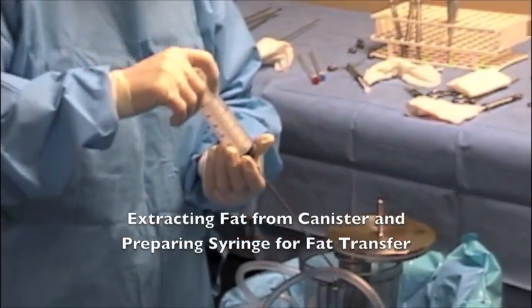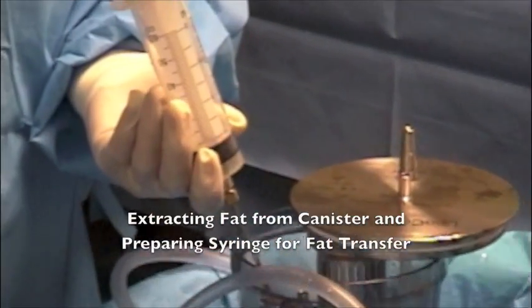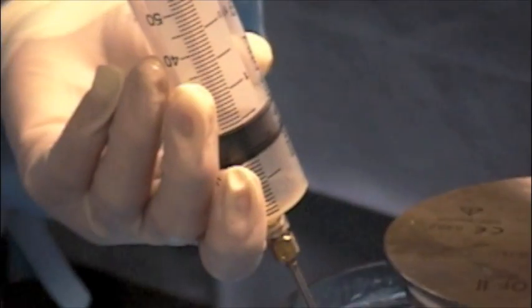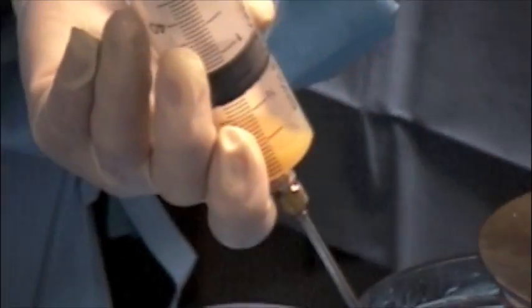So Michelle is now taking the fat out of the lipo collector that we're going to use for the fat transfer procedure, and you'll see how yellow it is. And there's really no blood. It's a really viable fat tissue.